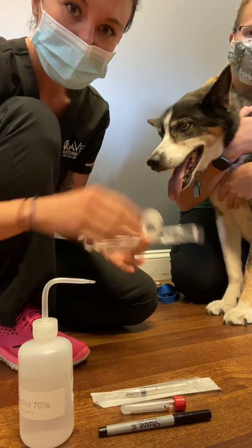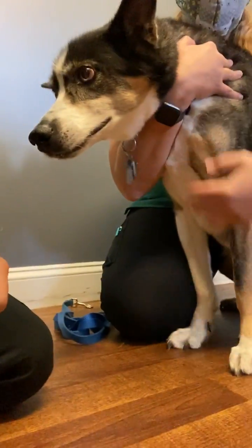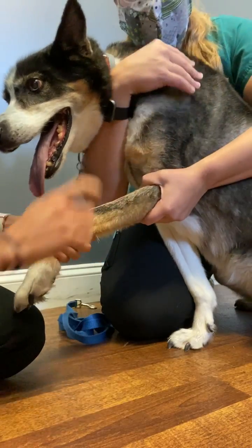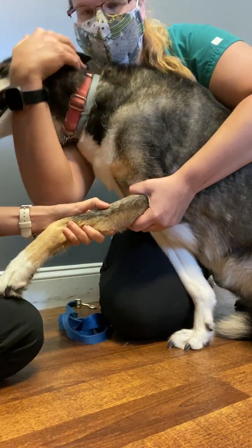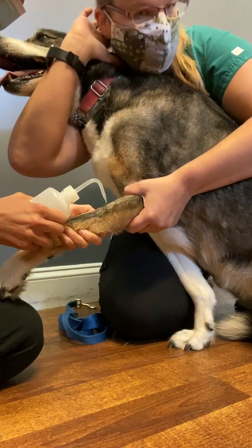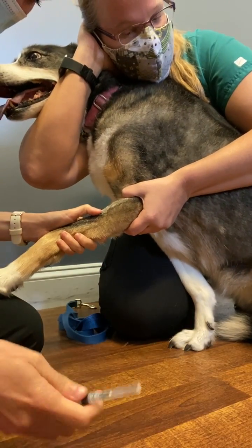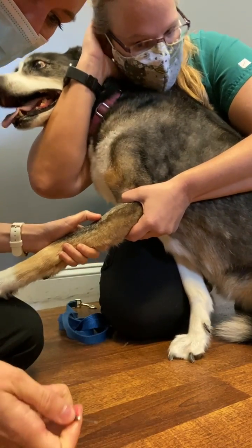I have my restrainer properly restraining my patient. I'll get you closer so you can see the blood draw. She's going to hold off the vein for me. I'm going to palpate the vein, which is right here. I'll go ahead and use alcohol, and whenever you poke with a needle you want to make sure it's bevel up, always.